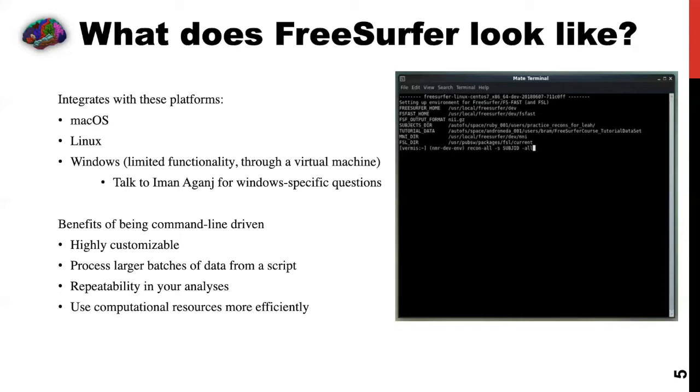But really, this is a developmental tool that allows a lot of flexibility within FreeSurfer. It's why we're able to add so many different components to it over the course of its operation. We're continually updating it, and it also gives you flexibility as you process your subjects, because you can add additional arguments to how you want your subject processed, or batch process subjects.